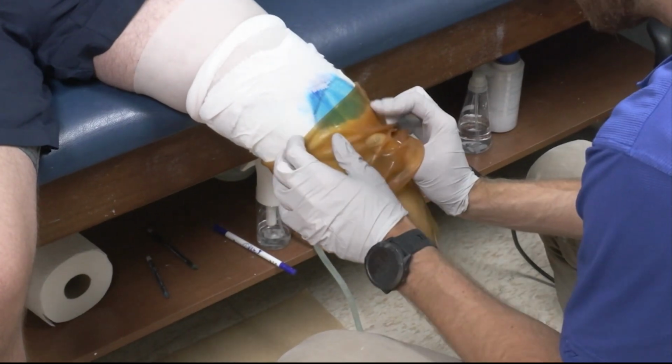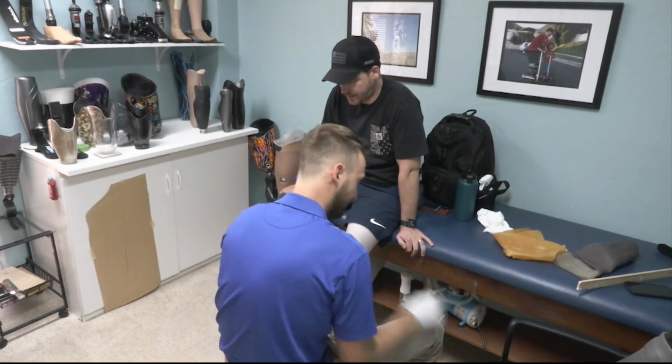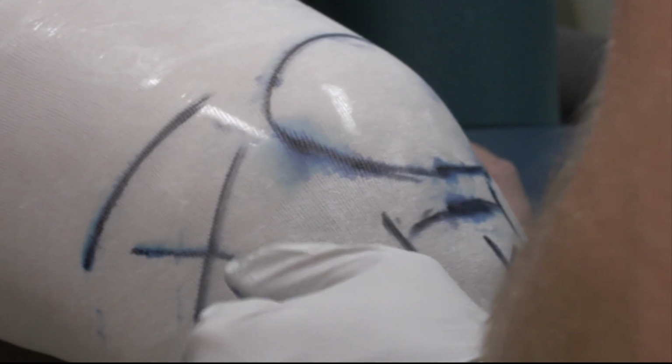Getting patients back to their day-to-day activities has been a little easier in recent years as technology has exponentially improved. Now devices can be 3D printed, and they have learned how the human body functions to better serve each situation. These microprocessor knees are intuitive, and they learn how amputees walk. Despite the hardships endured, one thing is clear.